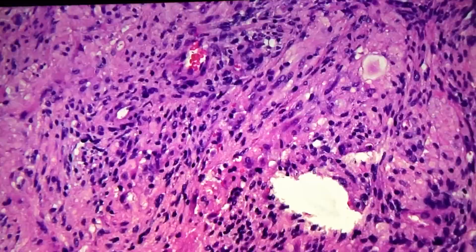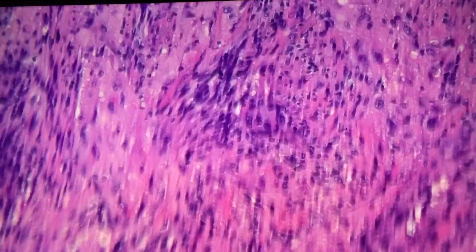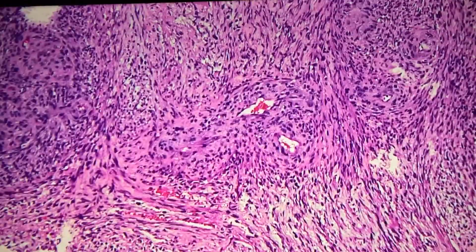So it has all the other stuff, the vascular endothelial proliferation, and all of that. Malignant. I'm sure there's necrosis somewhere. Yes. And mitotic activity. Of course, you'd want to make sure this is a high grade lesion. Yeah.